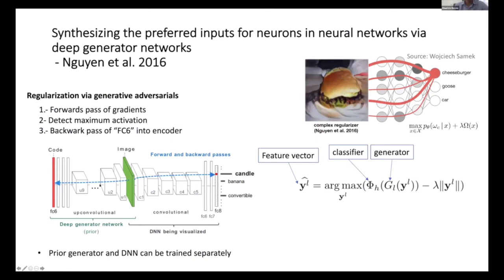So all these blocks over here are the counterpart units of the ones we have on the direct path, on the right side. By doing that, I'm actually creating an image that's more realistic than just purely mathematically finding a pixel by pixel image that, for example, describes a goose.